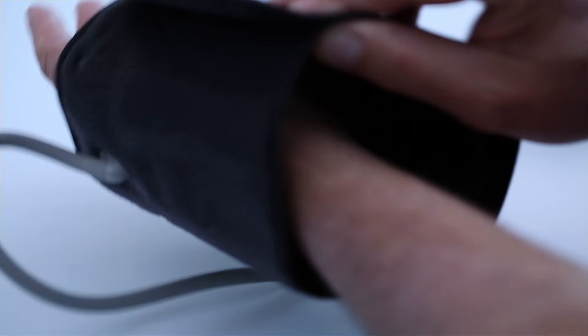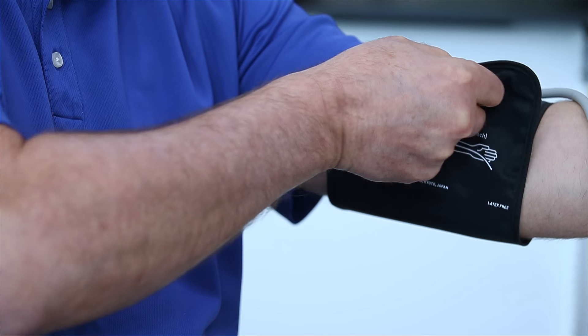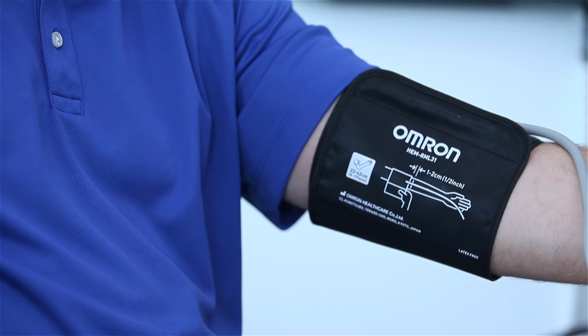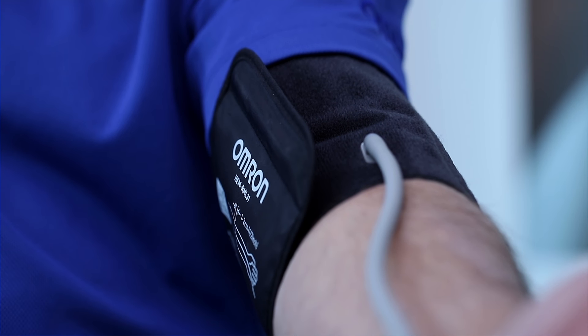Step 4. Wrap the arm cuff firmly in place around your left upper arm and secure with a fabric fastener. The arm cuff should be placed on your arm at the same level as your heart. Ensure the air tube is on the inside of your arm.